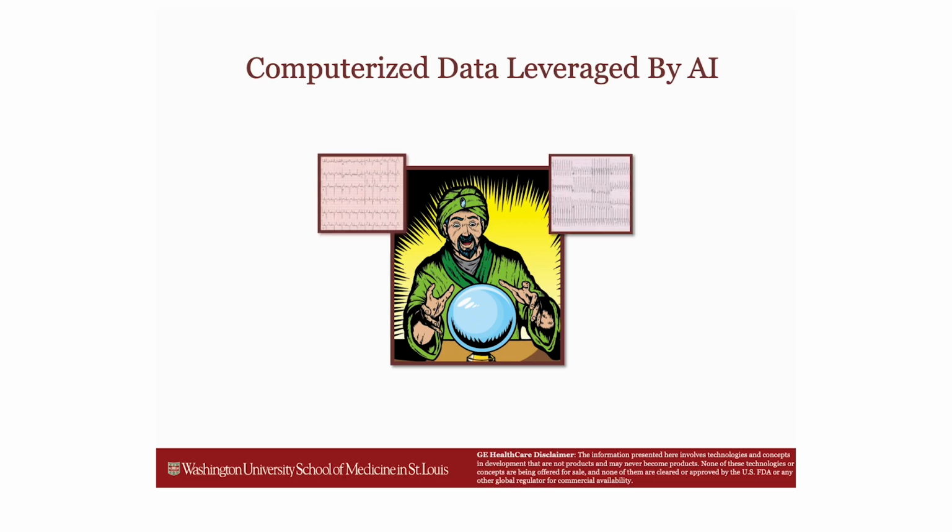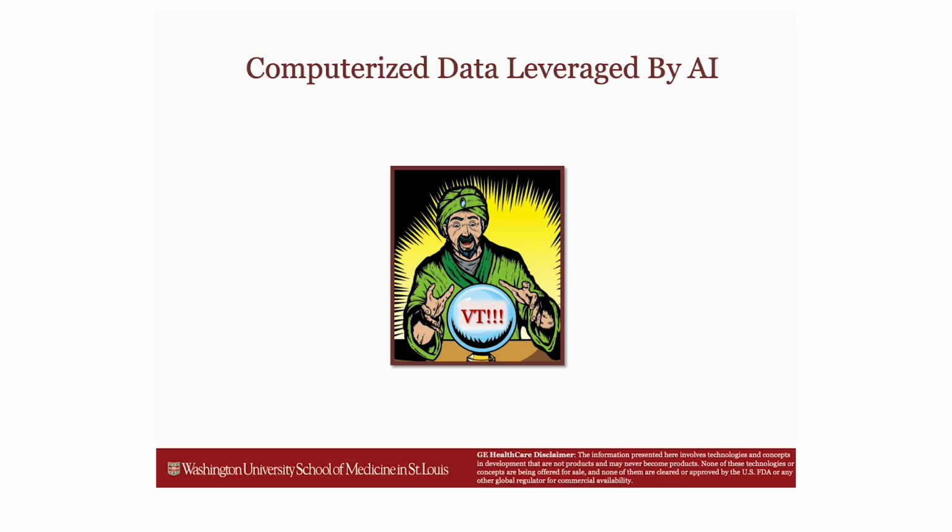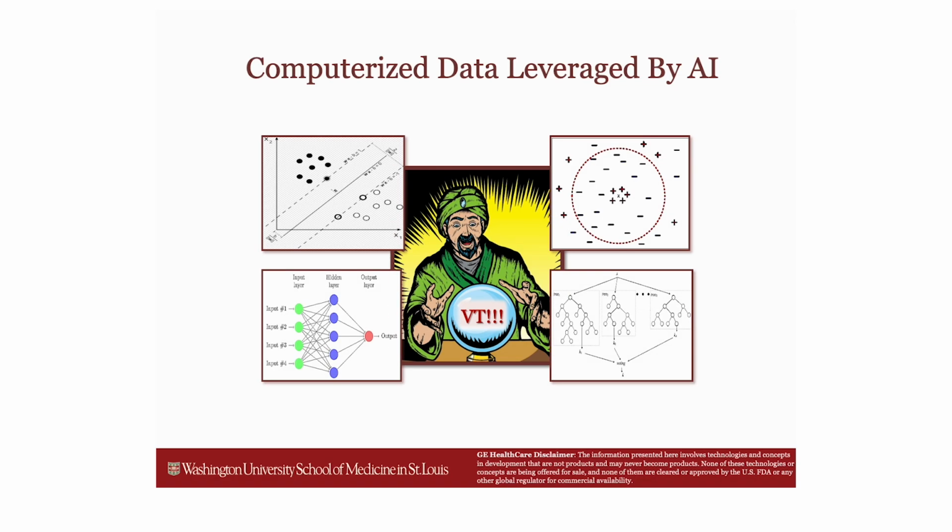So I can take data from a baseline 12-lead ECG, but also the wide complex tachycardia, and then I could arrive at a prediction. And I could use that modeling structure, and I could use different machine learning models such as support vector machines, fully connected neural networks, random forests, k-nearest neighbors to accomplish the desired task. But I didn't use just measurements.